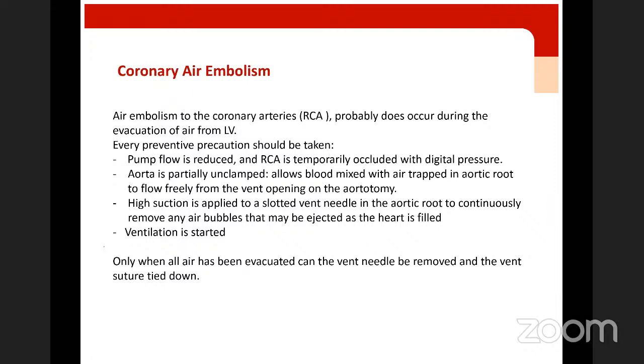Also, an aortic root vent with high suction continuously removes any bubbles ejected as the heart is filled. And of course, ventilation would be started. After complete de-airing, the vent needle is removed and the vent suture is tied down.